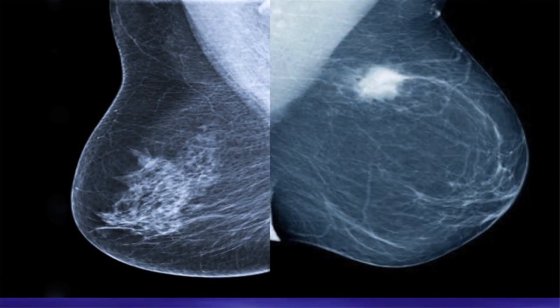Scattered fibroglandular elements, we see breast tissue. See these little reverse curves? We were talking about those earlier. Little curve here, little curve here. Little curve here, little curve here. Those are just the ligaments, and this is normal.